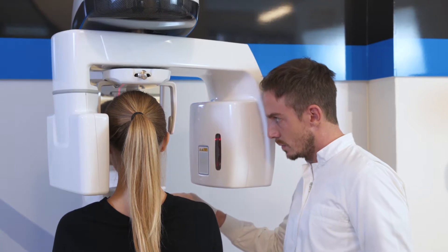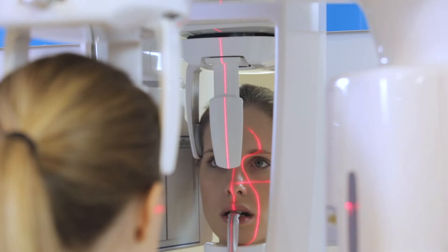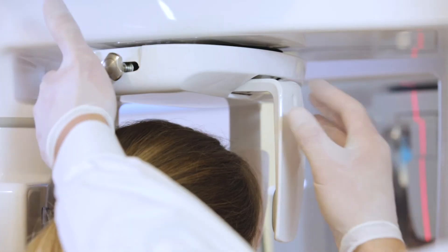Looking at the mirror and watching the vertical sagittal trace, facial symmetrical positioning can be improved.